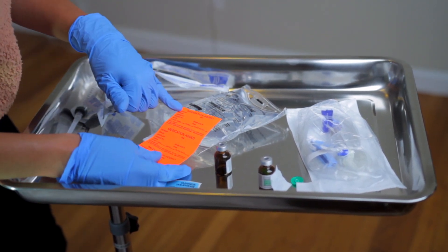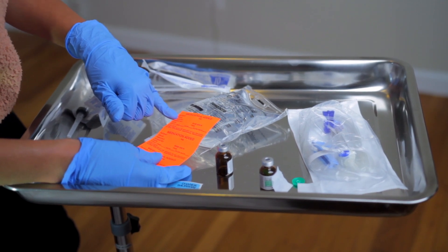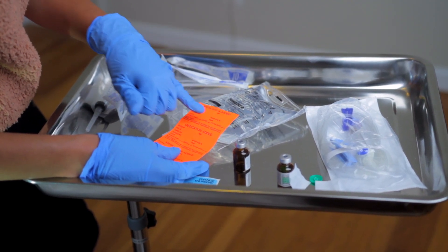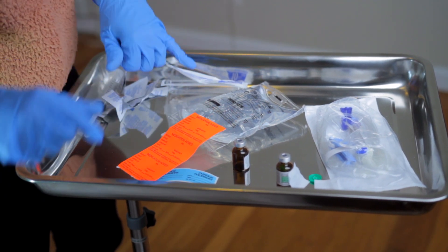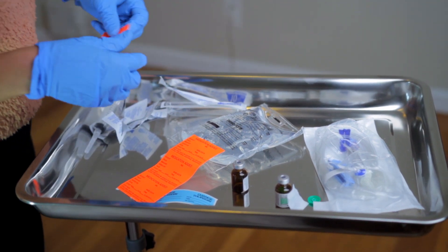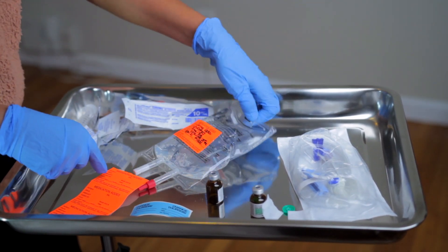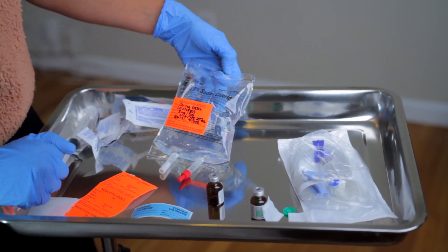Then I'm going to prepare my medication label — I'll put the right patient's name, the drug which is levofed, and the amount: eight milligrams per eight mils in 250 mils of normal saline. I'll put the date and time it, and also attach a patient label per hospital guidelines. Once the label is done, I'll put it on top of the medication bag and it is ready to go. If you need to double-verify your medication with a second RN, you would then double-verify before you prime it and hang it for the patient.